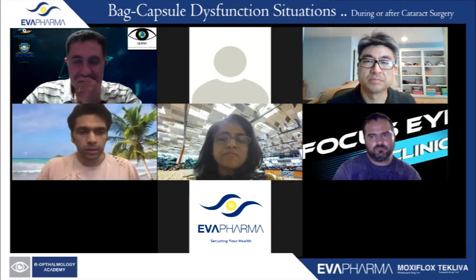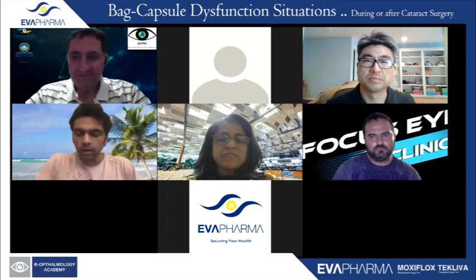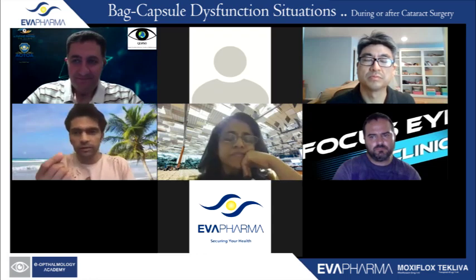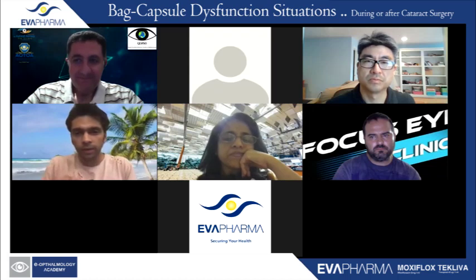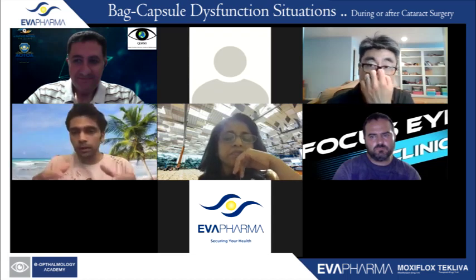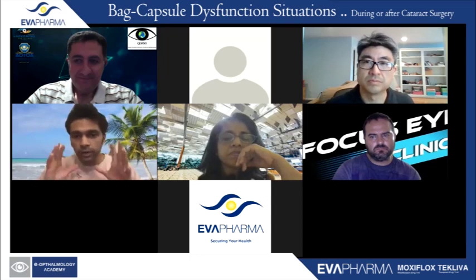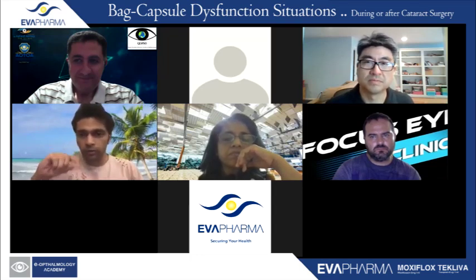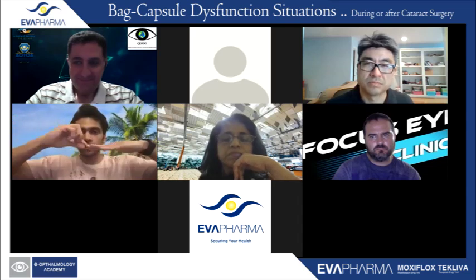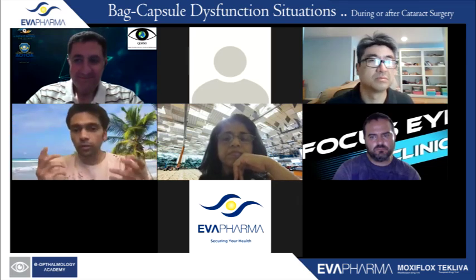So ECAL is something that I had spoken about and published in 2013. It was extrusion cannula assisted levitation. The extrusion cannula is a device usually used in retinal detachment surgery. When I was learning retina at that point of time, I was learning it for something else. But the frustration of actually picking up a plate haptic lens from the retina is something that only a surgeon can talk about, especially when he's not able to lift it. There's no gap to actually lift that lens, because you're going in a perpendicular fashion to lift something and you have to pinch on the retina, which is a pain.